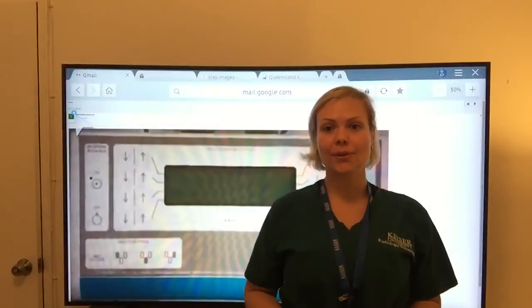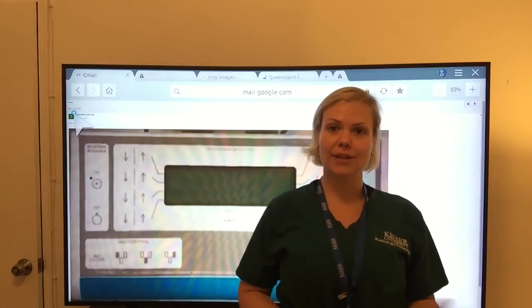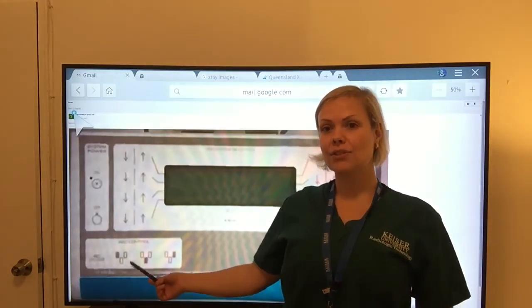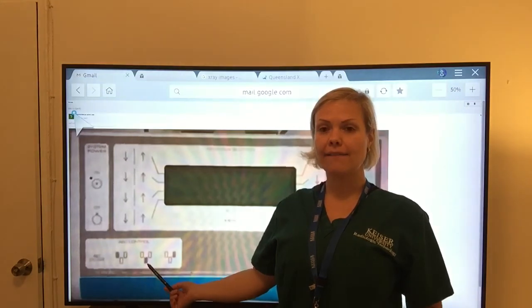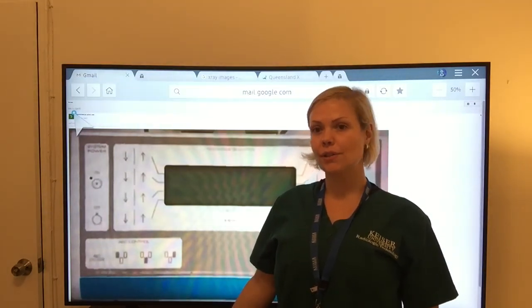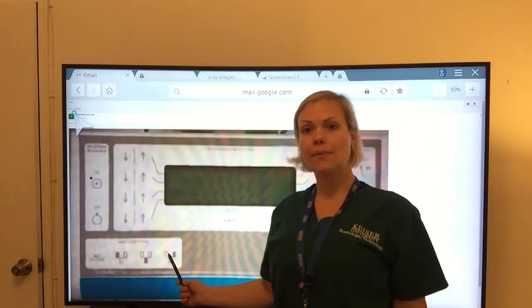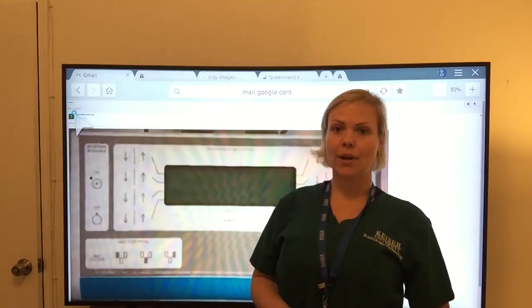I want to show you an image of the control panel that controls the X-ray tube and what the AEC control looks like. They have 3 different chambers, and they have 7 possible configurations. So you can choose 1 and 2, 1 and 3, or all 3 of them, and you can combine them in 7 different ways.